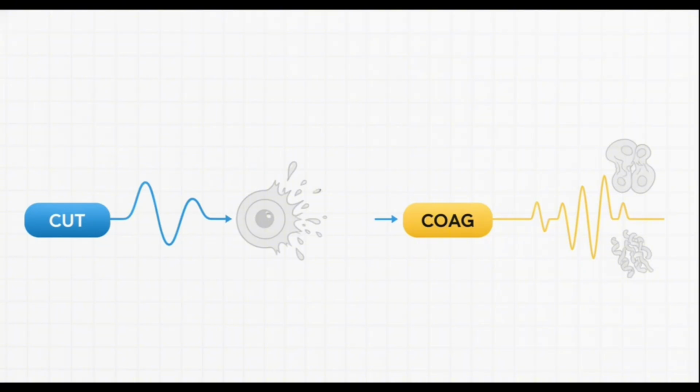Coagulation, on the flip side, uses a high-voltage, alternating, interrupted current. The mechanism here is completely different. It basically causes dehydration and protein denaturation, leading to cell death and a structural sealing effect entirely without that explosive tearing. It's a very high-yield distinction to keep straight, guys.